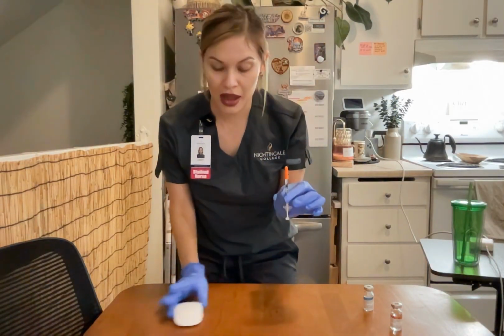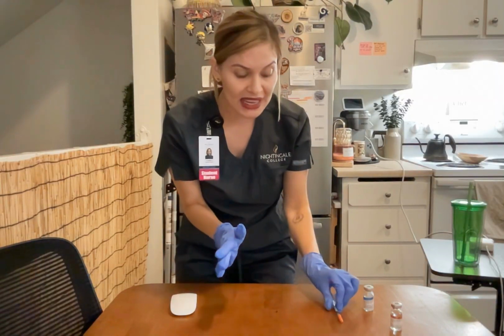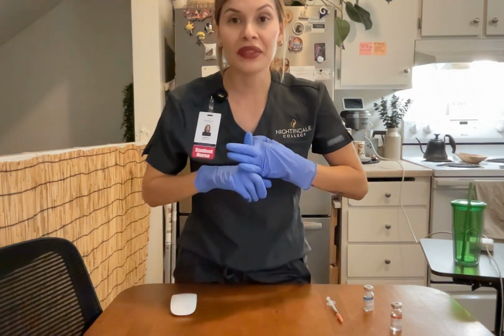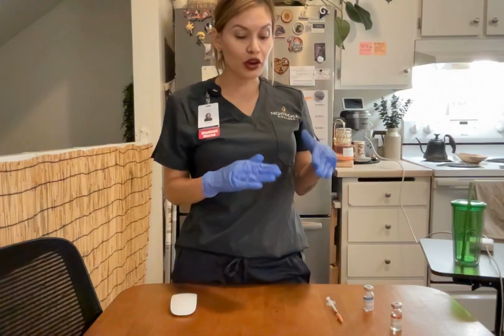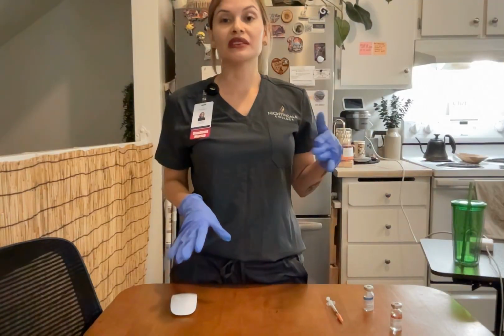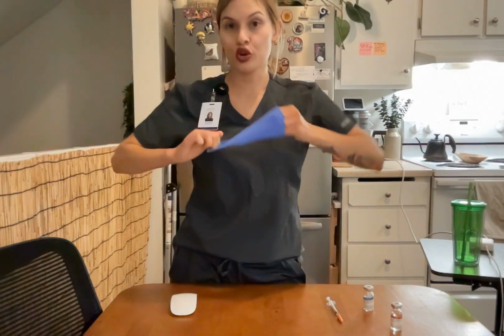Stabilize the cap, and if I fill the syringe away from the patient's bedside, then I will label the syringe, make sure that I put the full name, date of birth, and that I mark that there are 4 units of regular insulin and 8 units of NPH insulin for a total of combined insulin of 12 units. I inject the medication to the patient, clean up my area, remove my gloves, perform hand hygiene, and document the procedure.